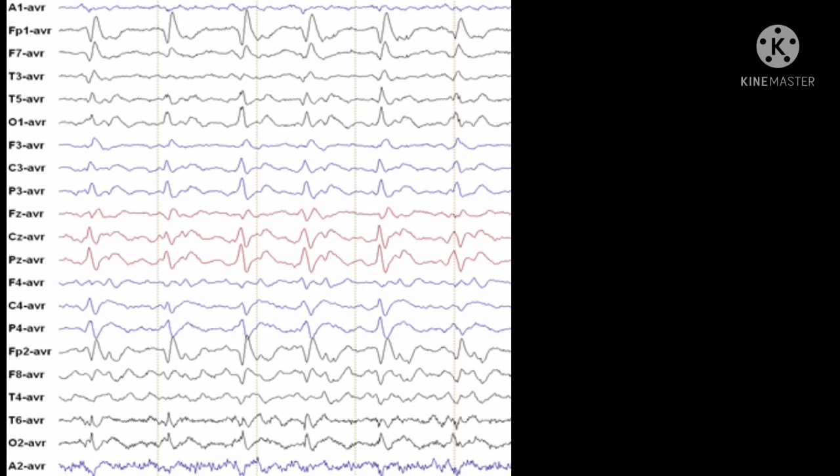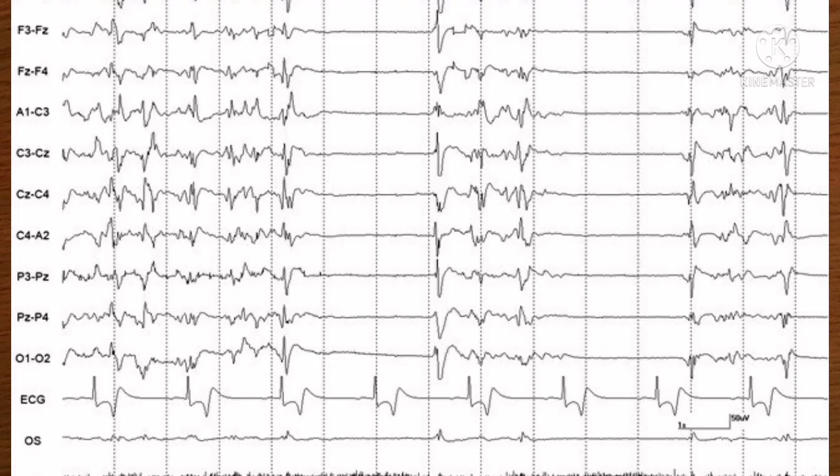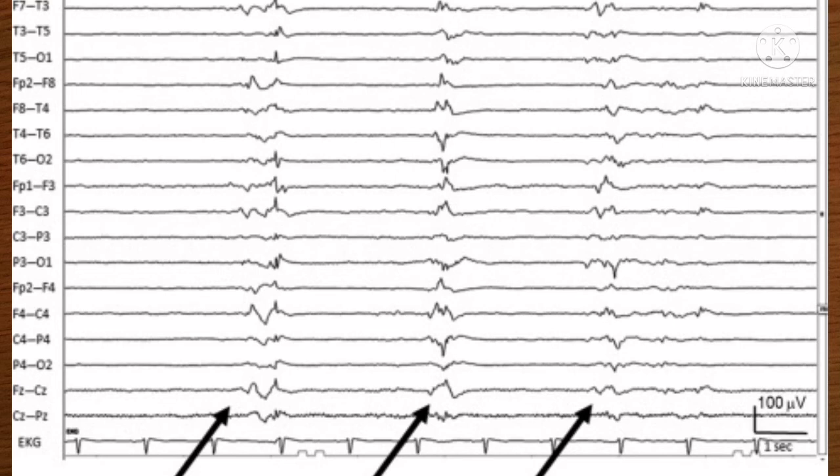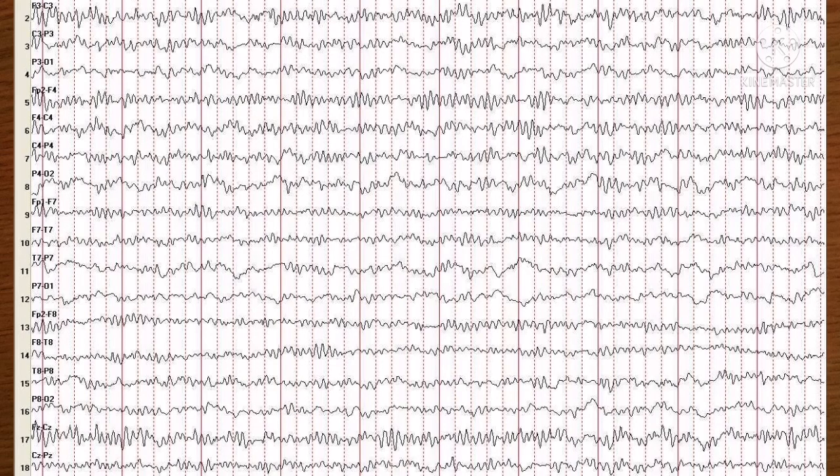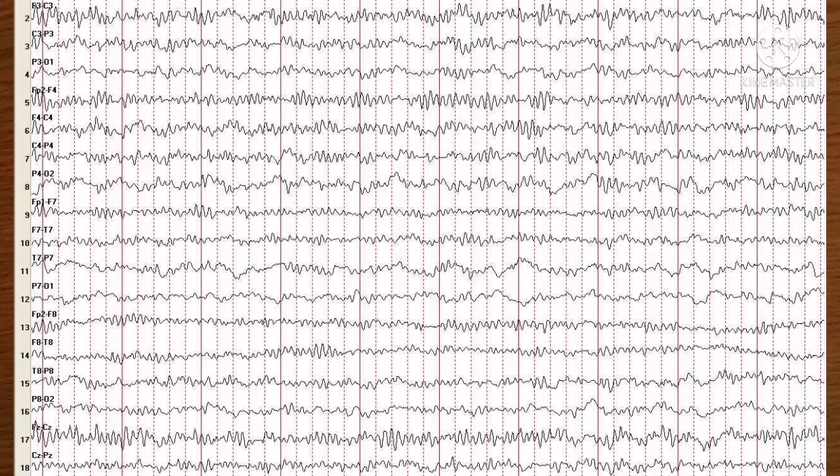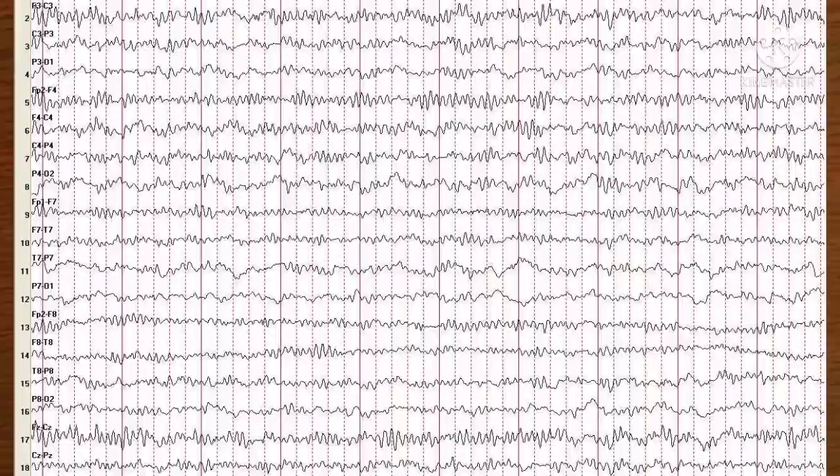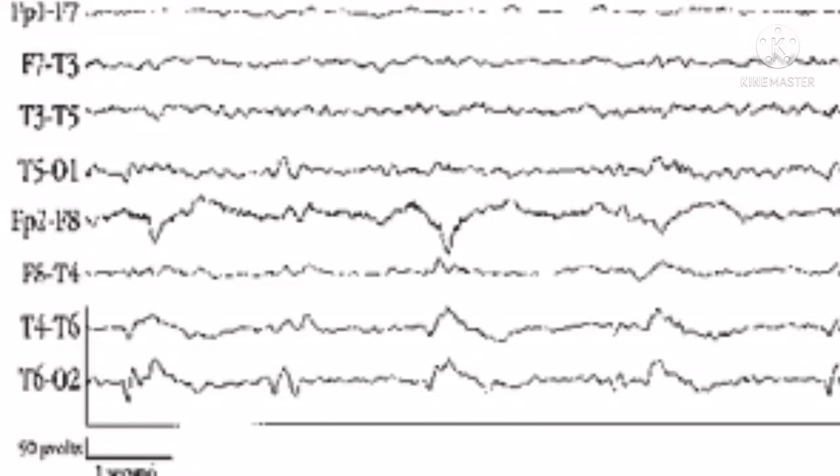Anoxic encephalopathy, we have from normal to isoelectric depending on the severity. Common patterns include burst suppression or periodic pattern that resembles Creutzfeldt-Jakob disease. Alpha coma is a diffuse non-reactive alpha activity with frontocentral dominance. These later indicate poor prognosis. Herpes simplex encephalitis shows generalized slowness with frontotemporal predominance, periodic complex of sharp wave or sharply contoured slow waves which appear irregularly as high amplitude discharge with a frequency of 0.2 to 1 per second, usually in the frontotemporal region.